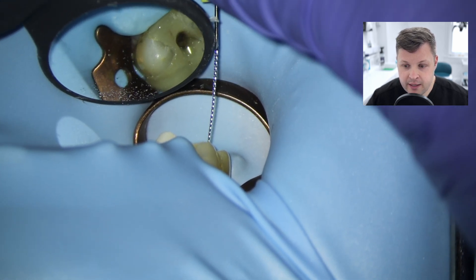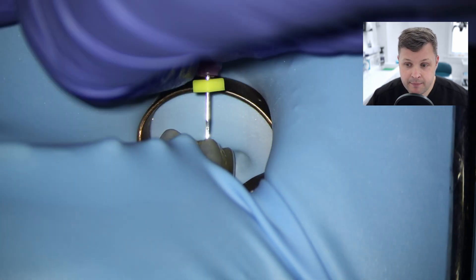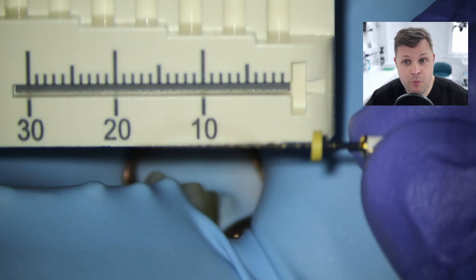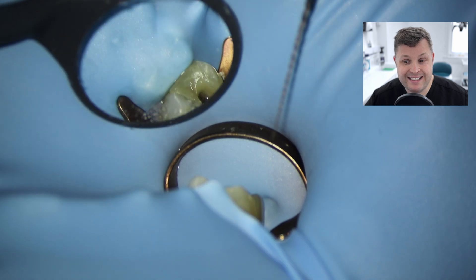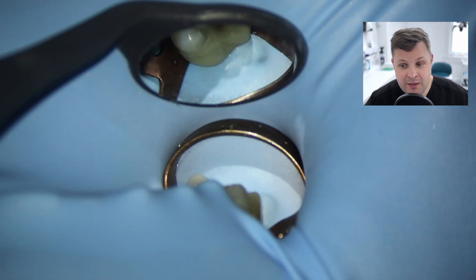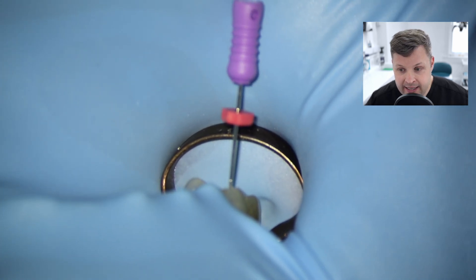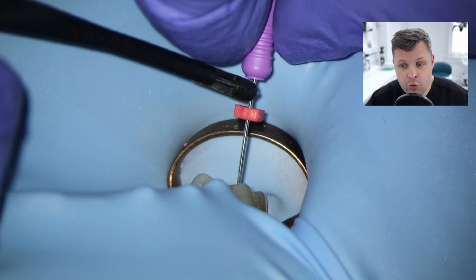Now going for the working length in the mesobuccal canal. Similar to the palatal, I can't quite reach zero again, so I'm measuring as far as I can get. The furthest point I can reach is 20 millimeters, and then I'm going to use that same stepwise motion. I've got my glide path file and I'm going to shape the MB canal up to 19 - one millimeter away from the furthest point. Don't be tempted to go any further; just use your patience and give it a bit of a clean. I'm trying to negotiate down using a gentle watch-winding motion, but I still cannot quite get all the way to the working length.